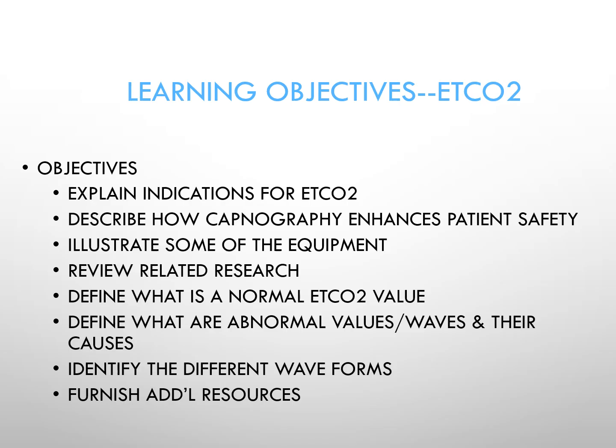We'll illustrate some of the equipment that's actually used, and there's different types of setups that you'll see, both for those that have artificial airways, so that are receiving invasive ventilation, as well as those that are not, that are spontaneously breathing. So capnography can be measured both, again, with folks that have artificial airways, that are in mechanical ventilation, as well as spontaneous breathers. We'll review the related research, both the traditional research as well as the research that has led to some of the more novel indications and uses.